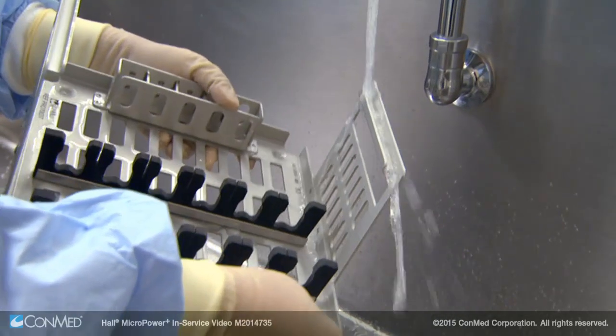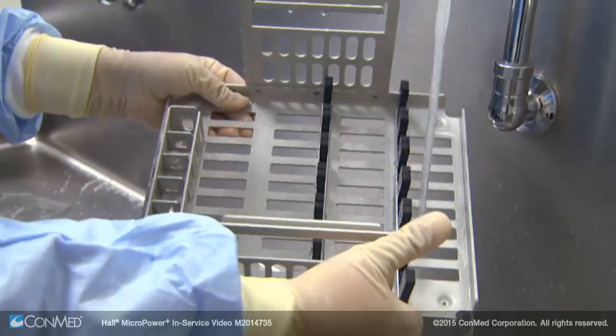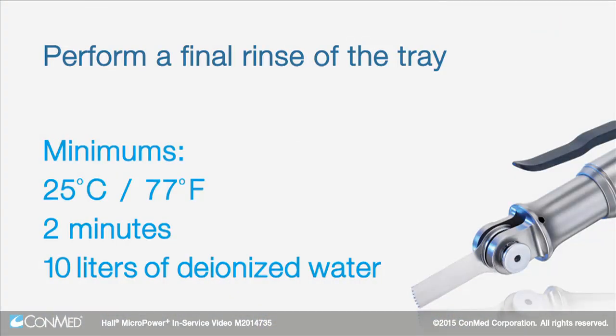Ensure the tray is visibly free of detergent or cleaning residue. Perform a final rinse of the tray for a minimum of 2 minutes using a minimum volume of 10 liters of deionized water to remove detergent residuals or debris.